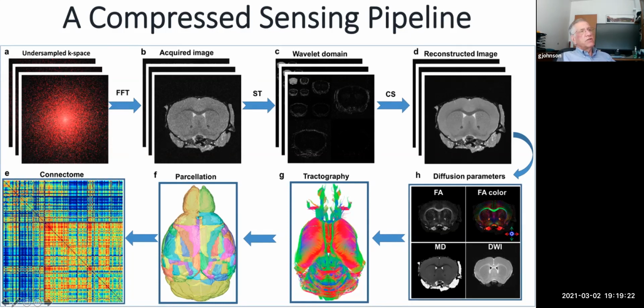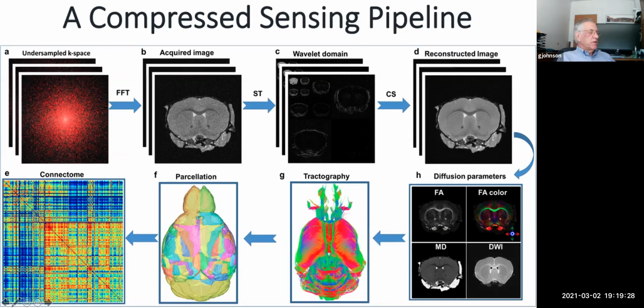You can do a series of transformations into another mathematical domain in which you replace the Fourier transform with a wavelet transform, and that allows you to minimize the structured noise that gets generated with these artifacts and gives you a baseline from which you can then do a more sophisticated reconstruction based upon iterative reconstruction. This is very computationally demanding. Where a Fourier transform image can be reconstructed in minutes, the compressed sensing data reconstruction takes place over an hour or so, and this requires a significant computational infrastructure, as we'll see in just a moment.